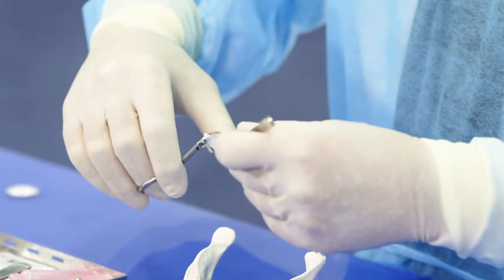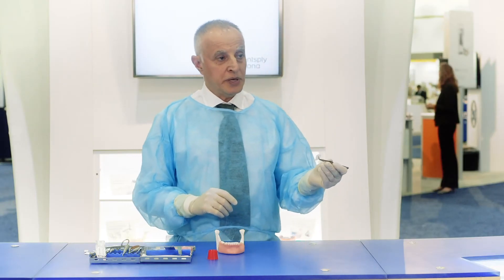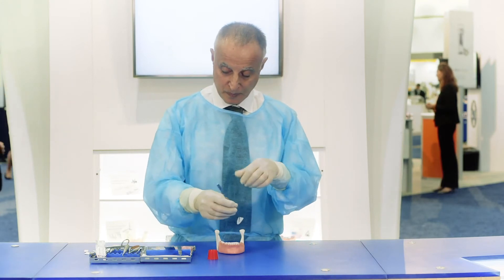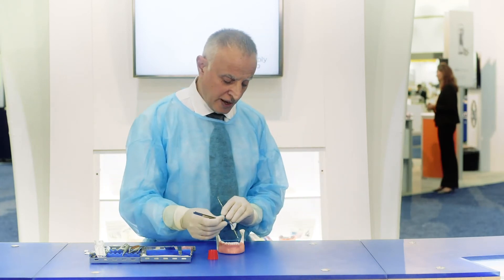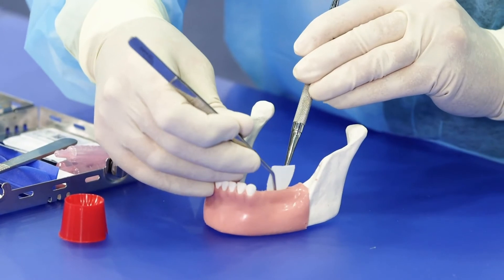The lingual aspect should be rounded as you see here. The round part of the membrane goes into the lingual side. We hold the lingual flap and push the O6 Plus under.